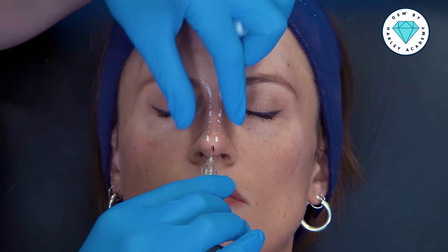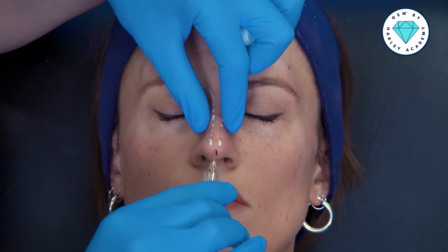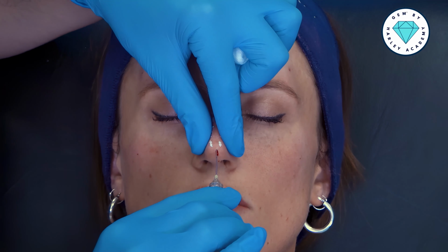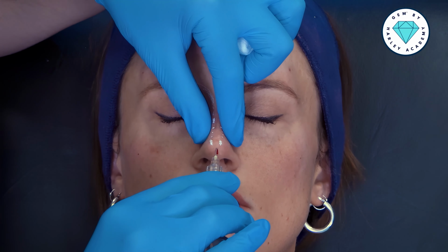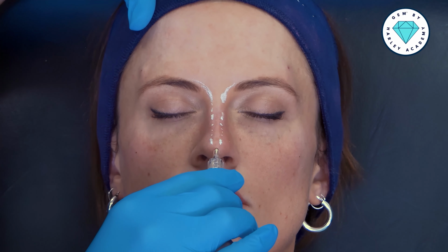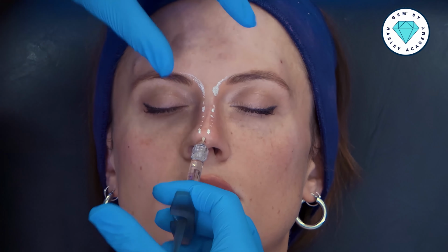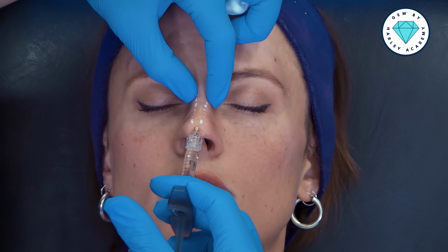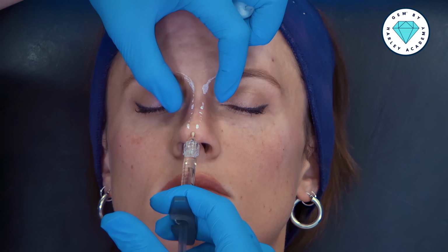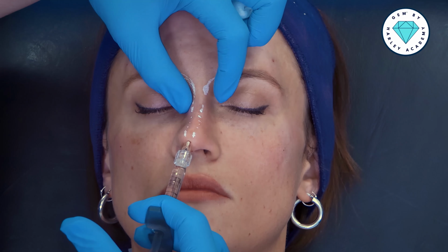First thing I'm going to do is advance my cannula beyond the dorsal hump. The right depth should be gliding in the nose. There shouldn't be any resistance. I'm now above the dorsal hump, and I'm going to create some volume to try and create a straighter dorsum.